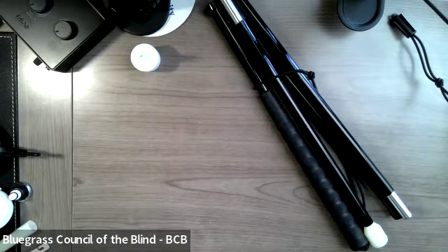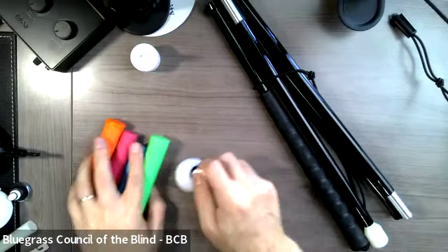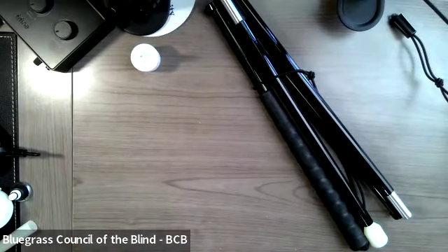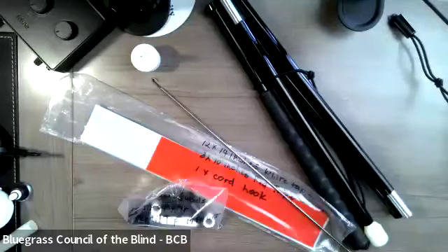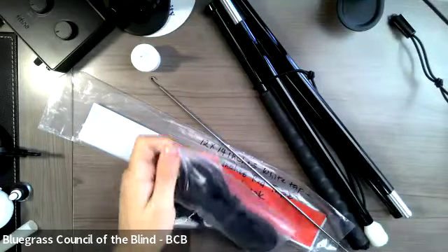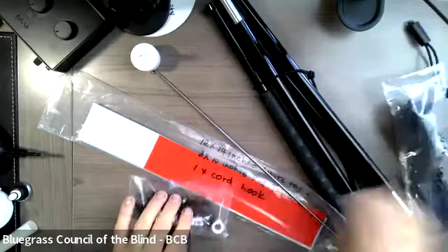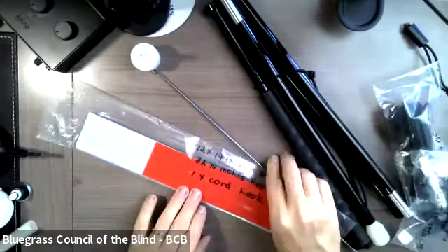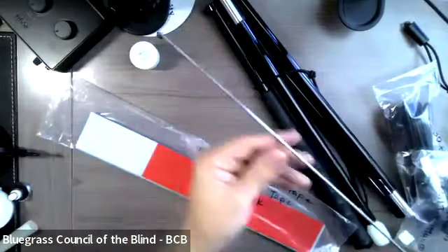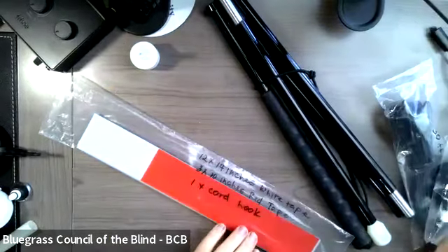Okay. Well, there you go, guys. So that was kind of a deep dive into Ambutech. One thing that I forgot to mention, which I will quickly mention, is that you can also purchase replacement parts for your cane. So if something were to happen to your cane, here's a bag of replacement bungee you can order. Here's some parts like the couplers in the middle. You can also get a hook, a bungee hook to fish the bungee through the different sections.